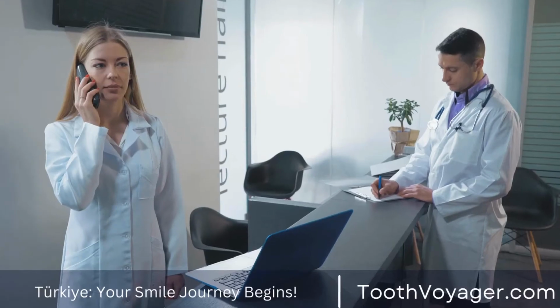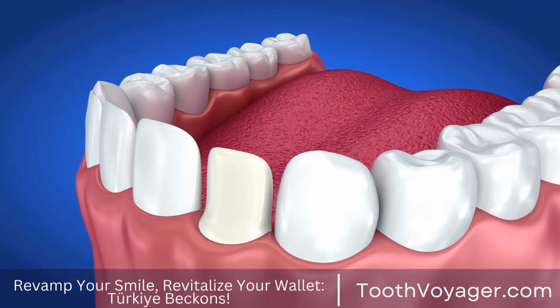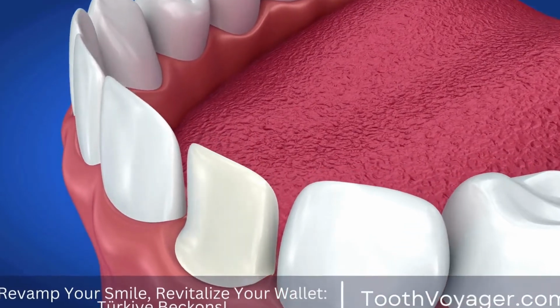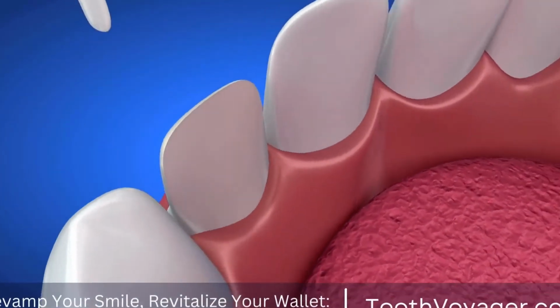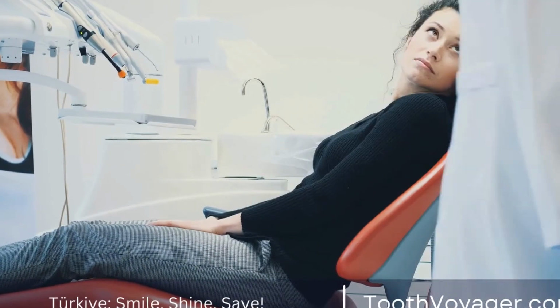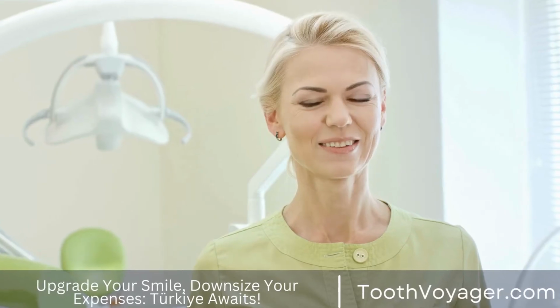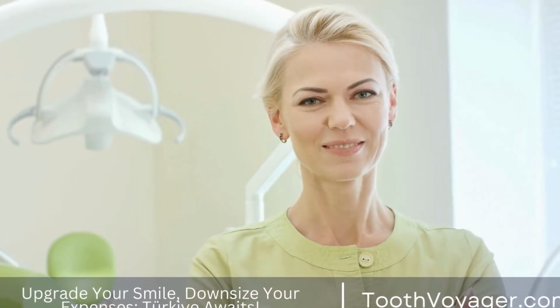The most common treatment for gum disease is scaling and root planing. The process is normally carried out by a dentist or dental hygienist. The procedure involves thorough cleansing of gums and teeth in order to get rid of tartar and bacterial buildup. Scaling is the procedure of getting rid of plaque and tartar off the surfaces of teeth. Root planing involves smoothing out the root of the teeth, preventing bacteria from sticking to them again.